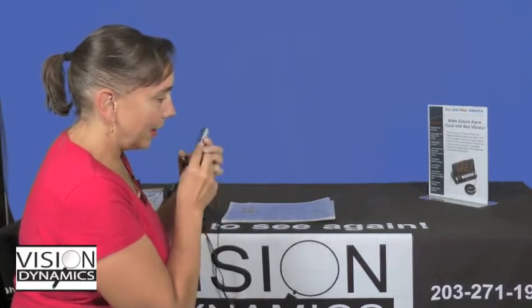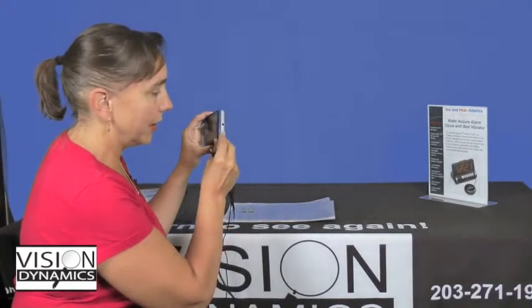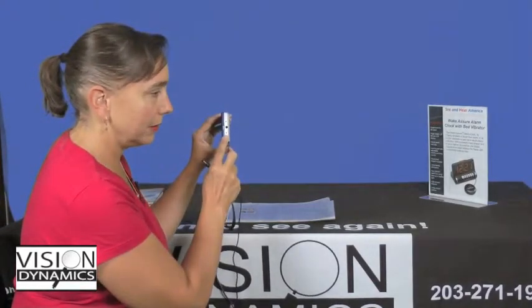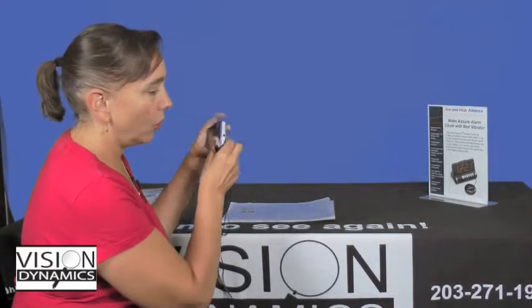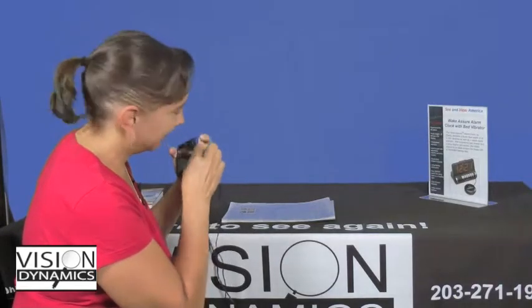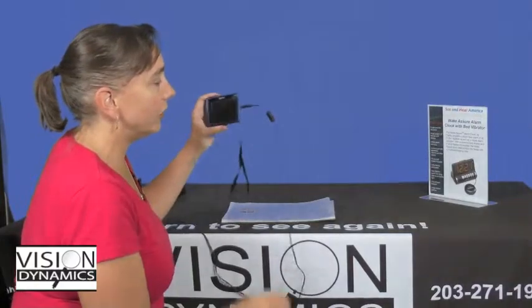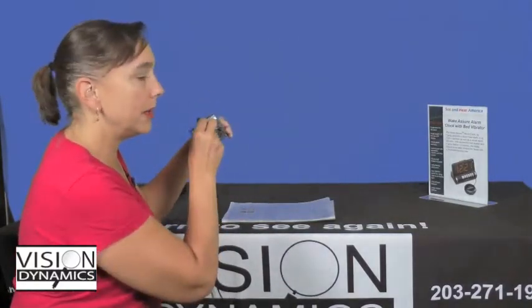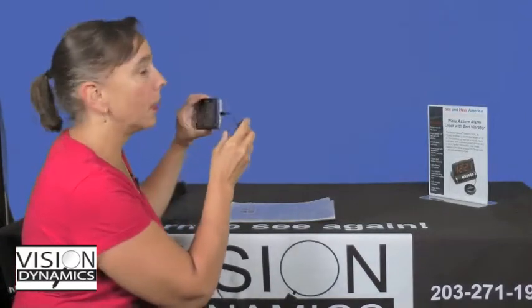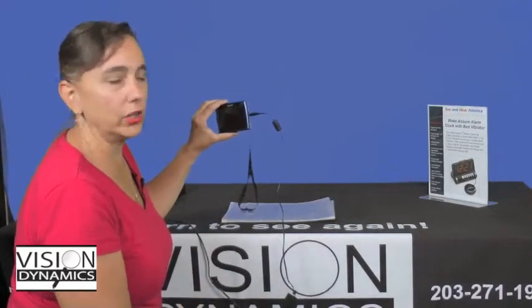Now, that charging hole is going to be found just above. If you look at the screen, on the right hand side you've got your on-off button, and then just above that is the hole where you stick in the charger. And let me feel for it here and plug that in. Now it's going to take a good several hours to get that first full charge, and there'll be a bright orange light that turns on. When that light is on, your Mini is charging. When the light is off, it's all done.